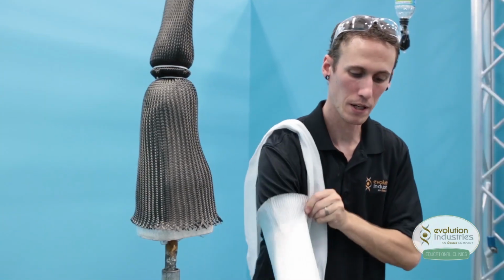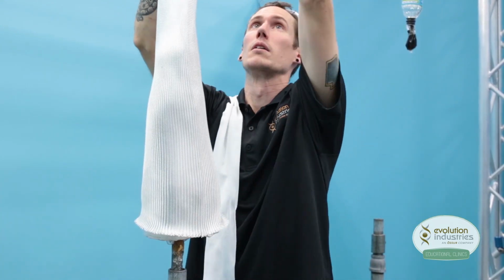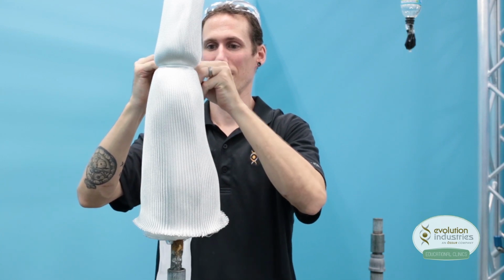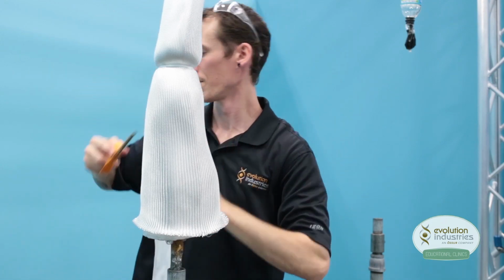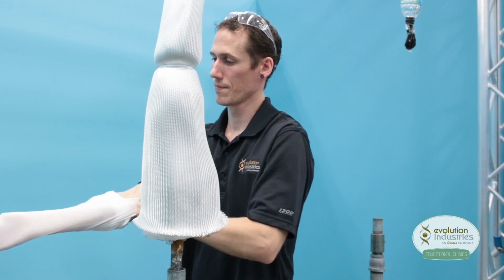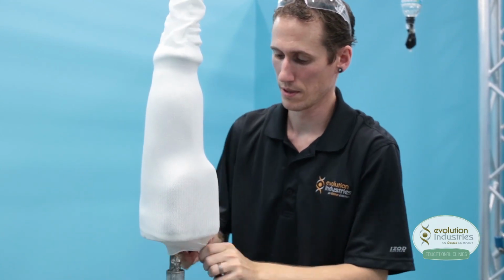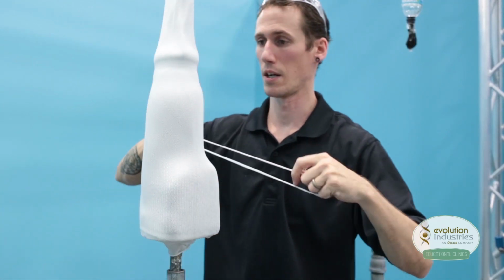Then we use 1 piece of fiberglass, double the length of the mold, slide it over the carbon, and similar to the first time, we tie it into the groove of the plate only. And then our nylon. Same thing, double the length. That goes over the fiberglass. Make sure it's pulled nice and tight. Tie it into the groove of the plate.